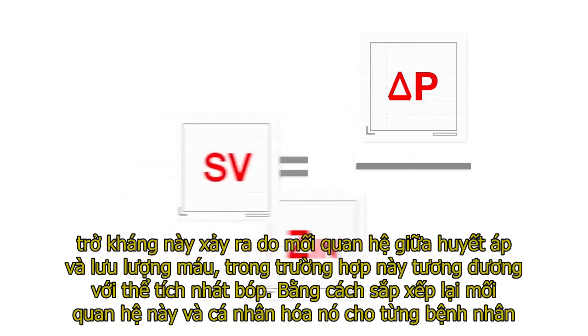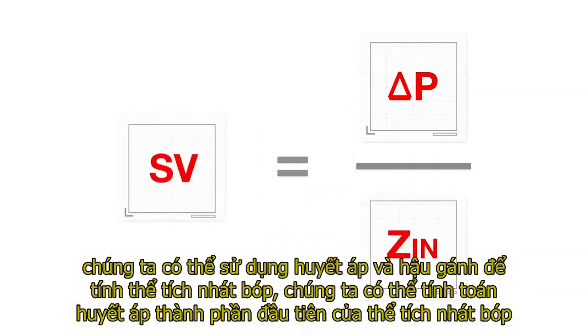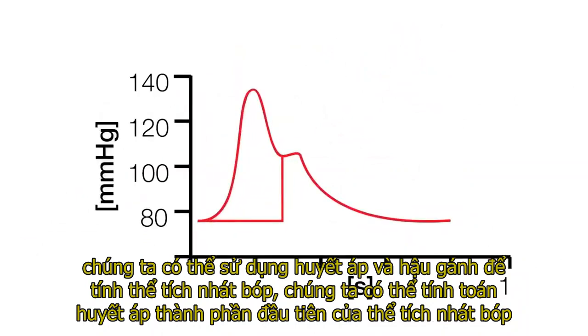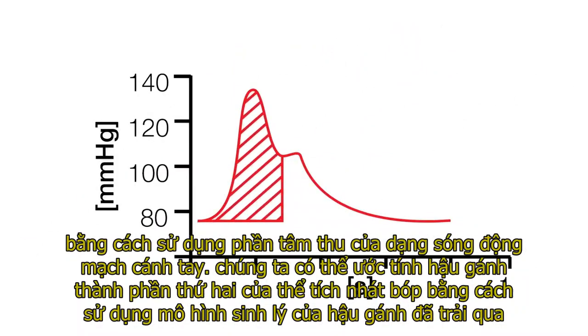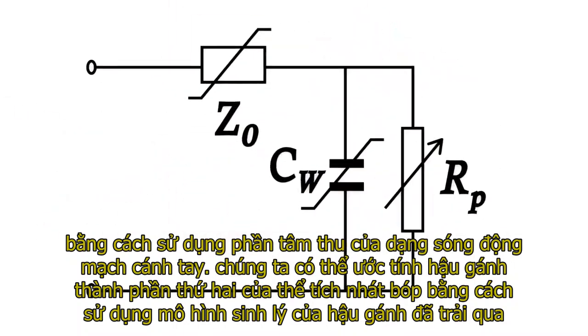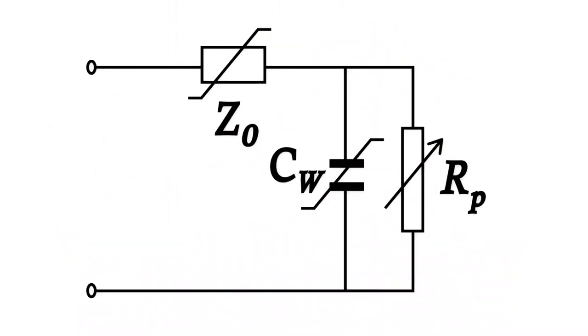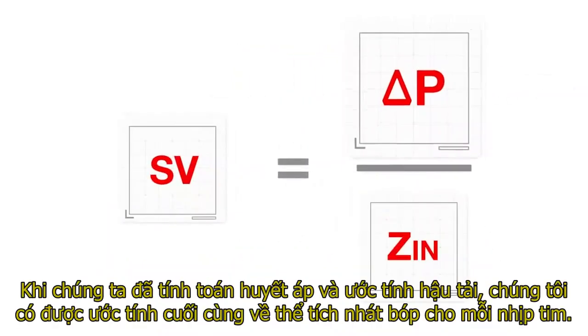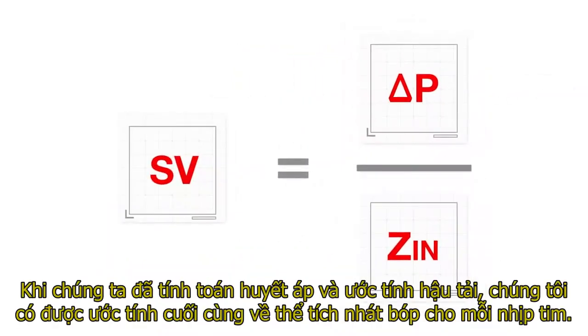By rearranging this relationship and individualizing it for each patient, we can use blood pressure and afterload to calculate stroke volume. We can calculate blood pressure, the first component of stroke volume, by using the systolic portion of the brachial arterial waveform. We can estimate afterload, the second component of stroke volume, using a physiological model of the afterload experienced by the heart. This model is individualized for each patient using the patient's age, gender, height, and weight. Once we have calculated blood pressure and estimated afterload, we obtain a final estimate of stroke volume for each heartbeat.